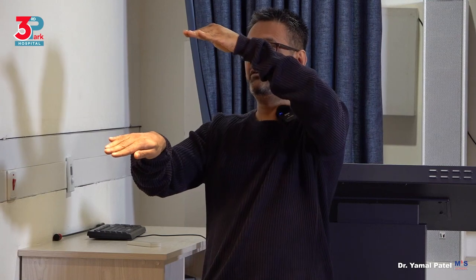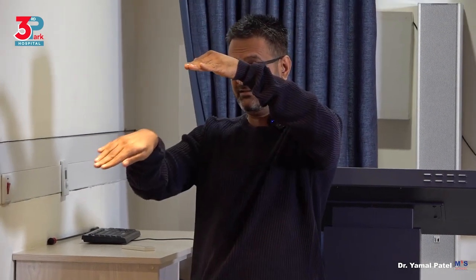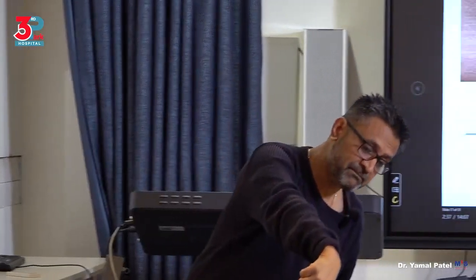Now, if I go too far off, 30 degrees, I'll be able to cut here, but here it's going to be very far from me because my instrument is here. It's straight. It's never going to go 30 degrees down. So if I'm seeing the pathology at 30 degrees, but my electrode cannot go to 30 degrees to cut it, I will struggle.